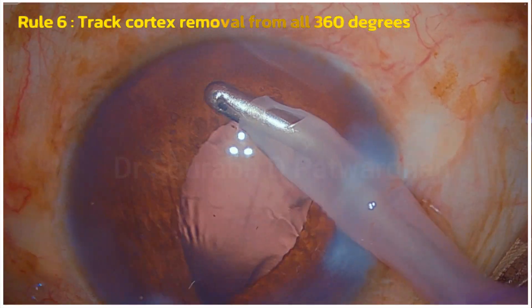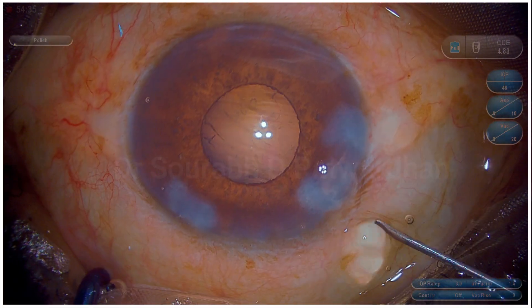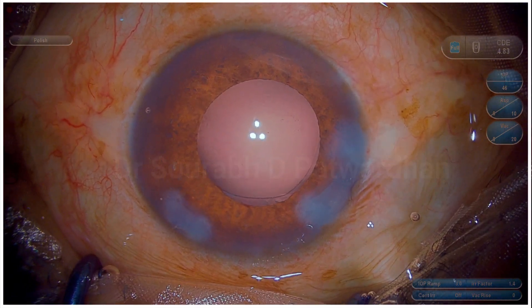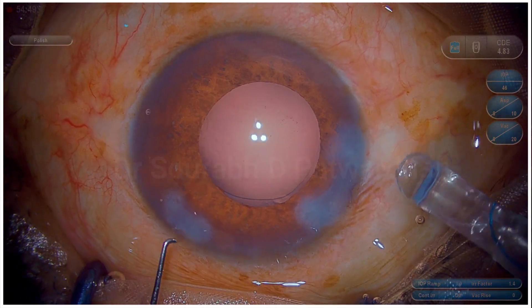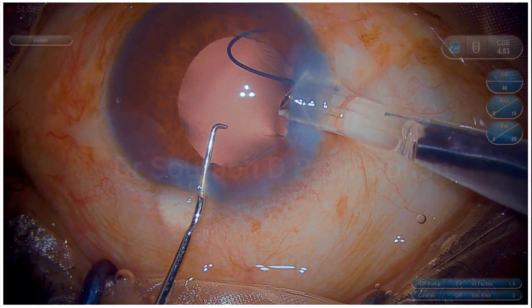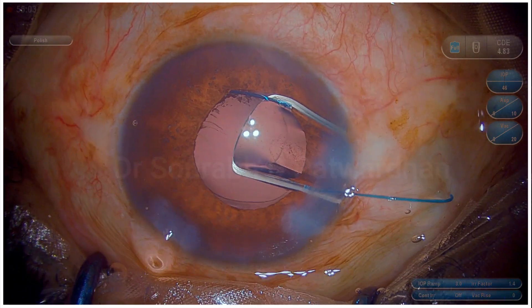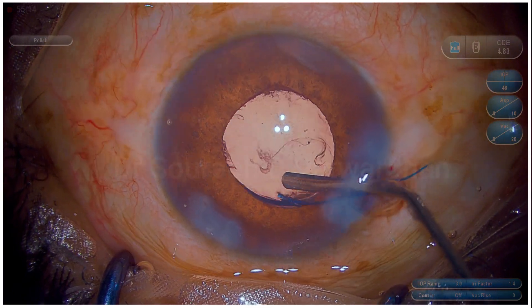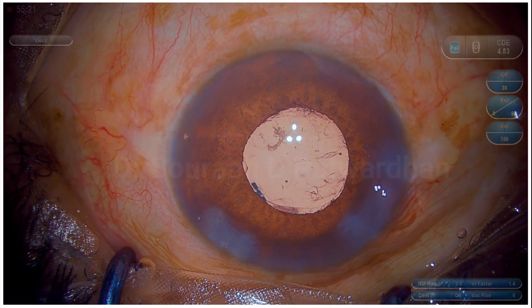I am going to use a three-piece IOL here — not because of any particular indication, but in my routine cases I use three-piece IOLs often, and it's a good IOL to place in the bag as well. The IOL is already loaded; the leading haptic is on the right side, so I need to rotate the injector a little bit clockwise as I enter. The leading haptic has gone directly into the bag. I am going to inject some OVD to form the anterior chamber and put the optic in the bag, then push the optic so the trailing haptic goes nicely into the bag.